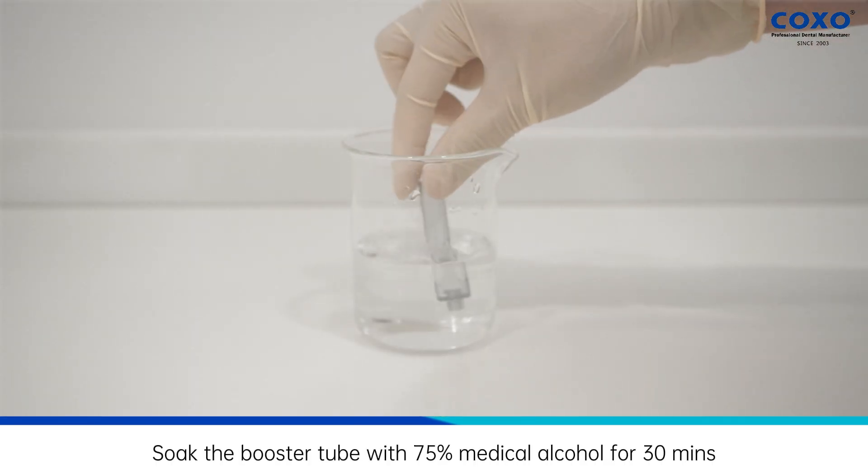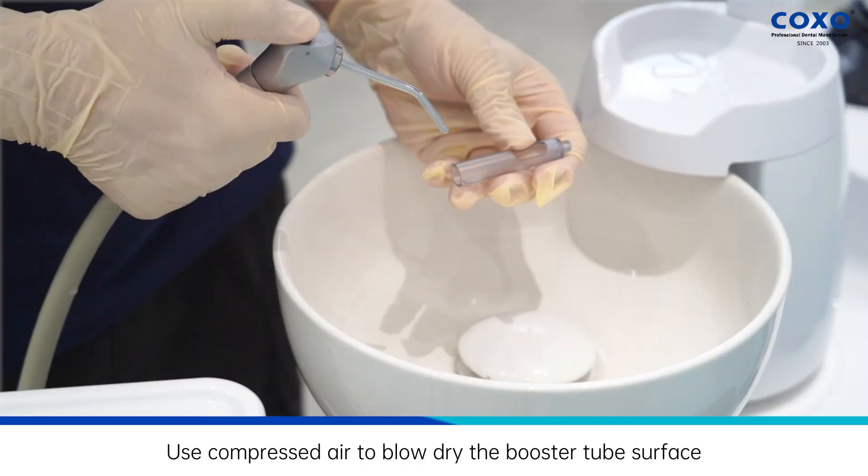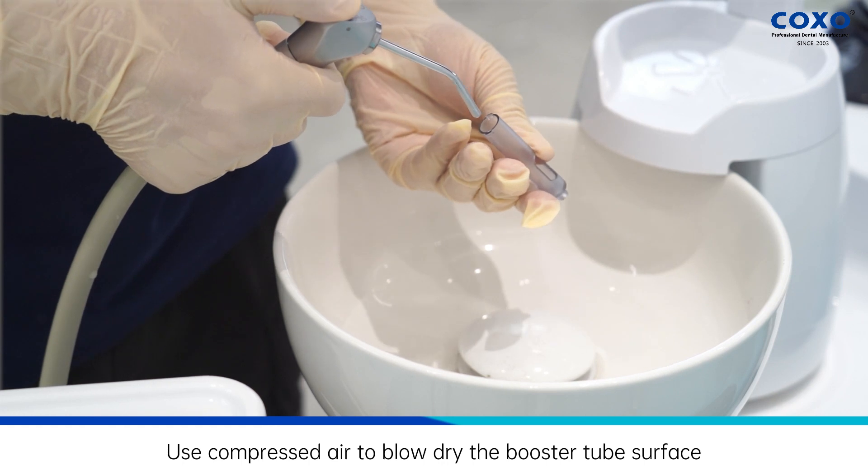Soak the booster tube with 75% medical alcohol for 30 minutes. Use compressed air to blow dry the booster tube surface.